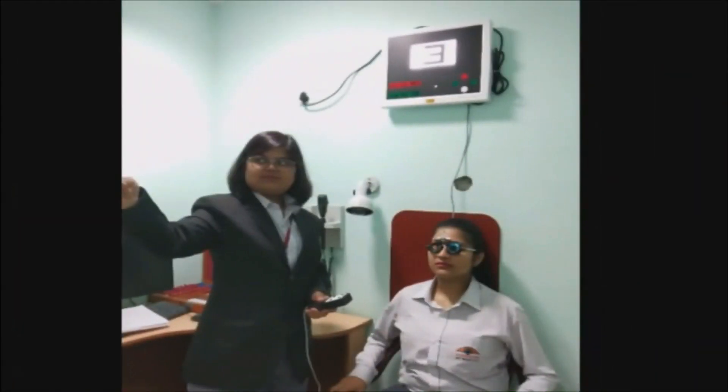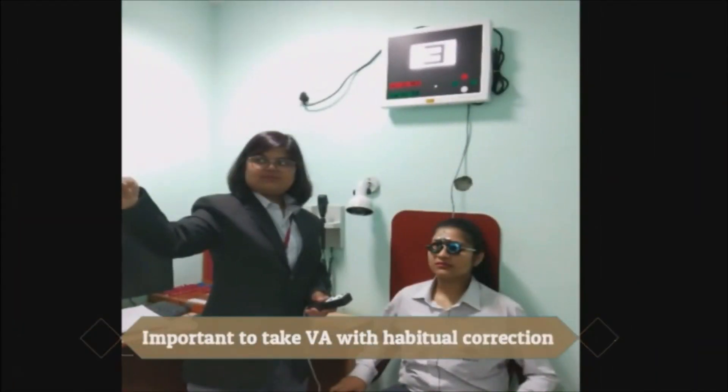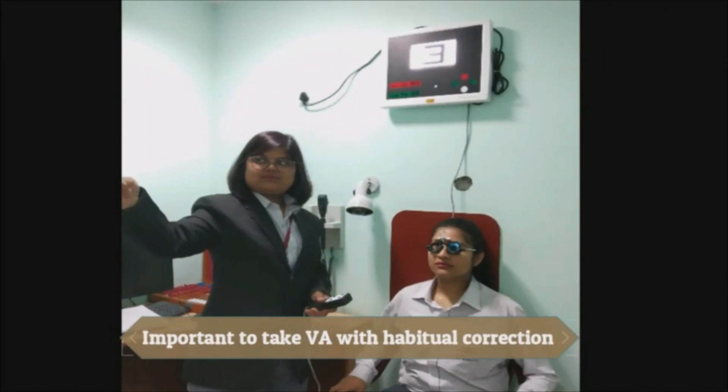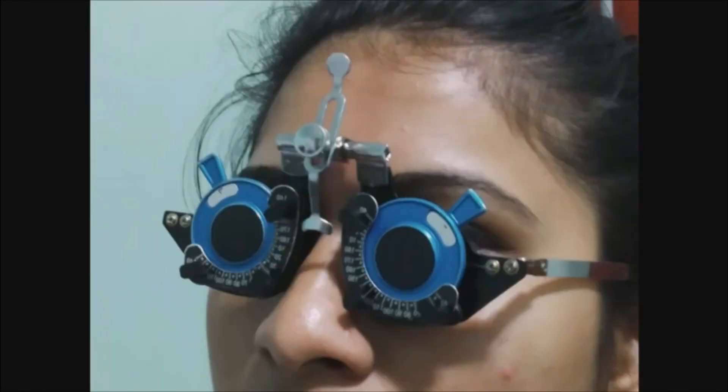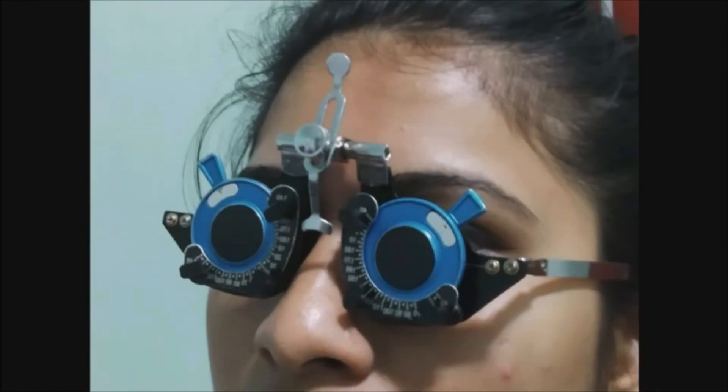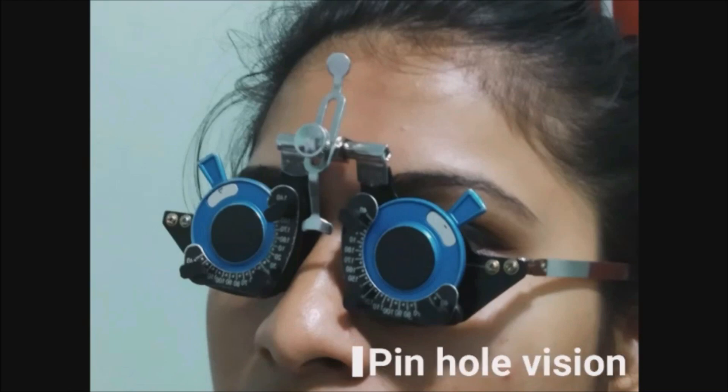While examining the visual acuity, we will be checking the distance as well as near visual acuity with and without correction, along with pinhole to check for any ocular media opacity.